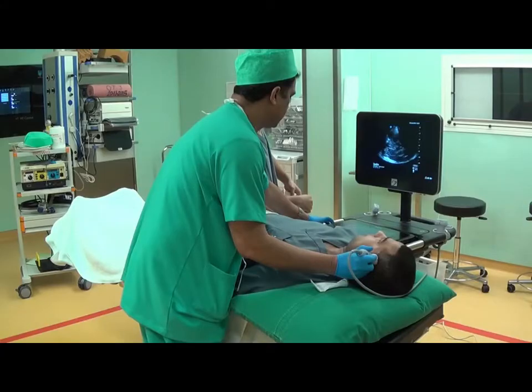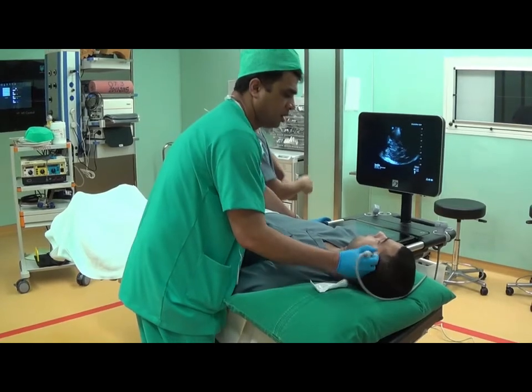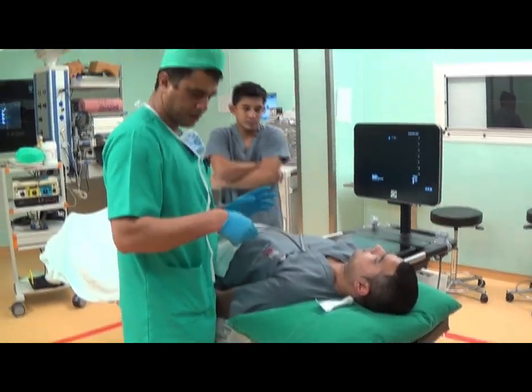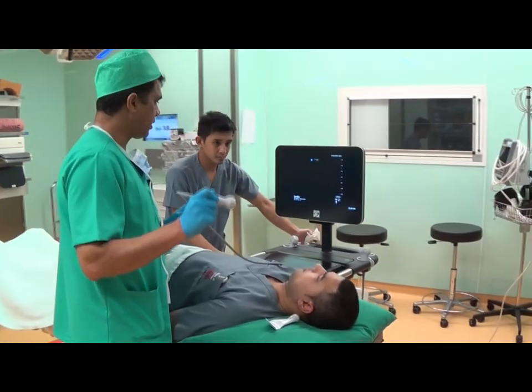So this is a video already posted on the website. You can. All right, this is the transcranial Doppler examination demonstration. This is Warburg's phased array probe.